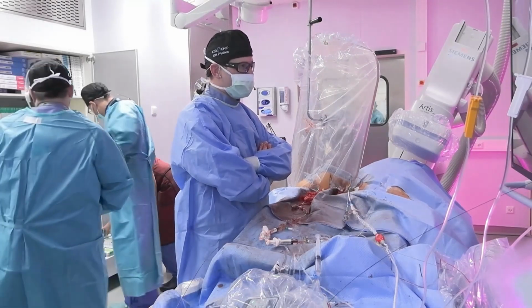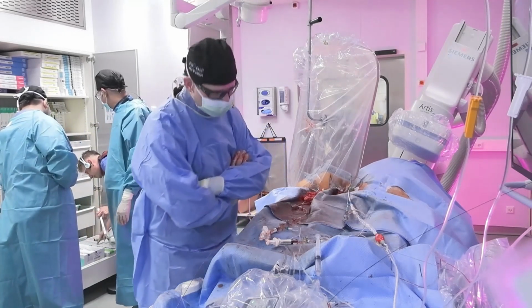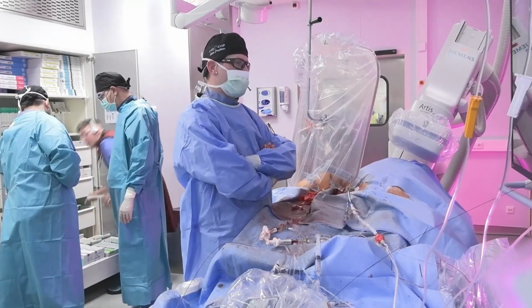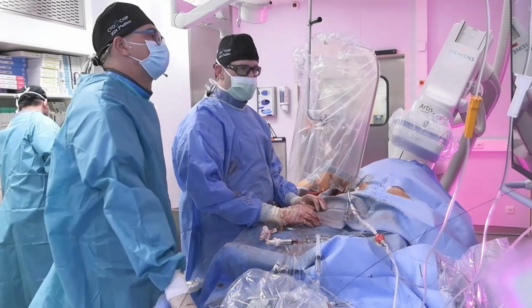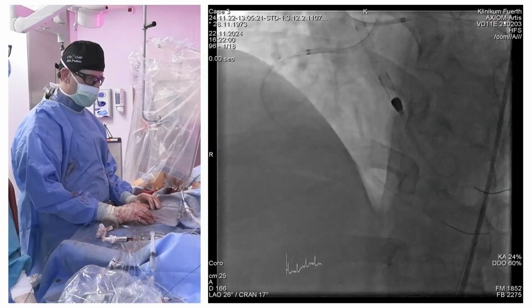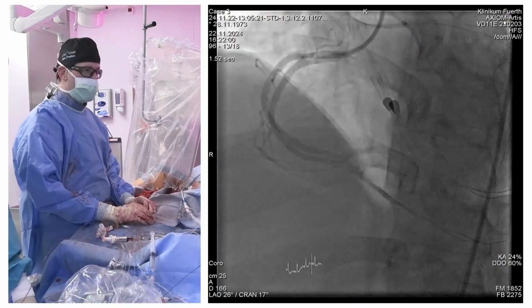which DCBs do you actually prefer? Do you also use sirolimus DCBs, or do you basically stick to paclitaxel? I mean, we have been part of SELUTION DeNovo, so we're going to see what's going to come out there. We have seen basically not a big difference between the SCB and paclitaxel-coated balloons from B. Braun.